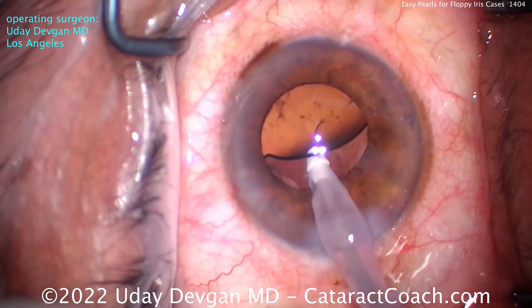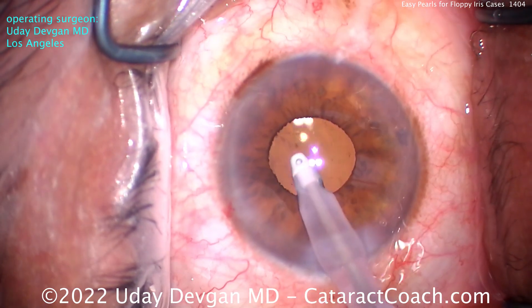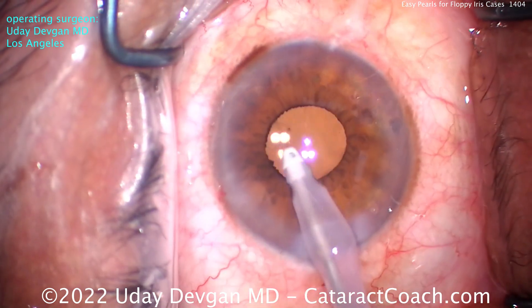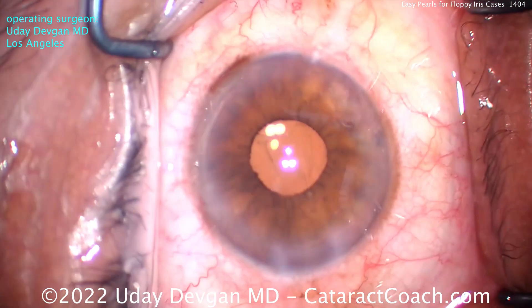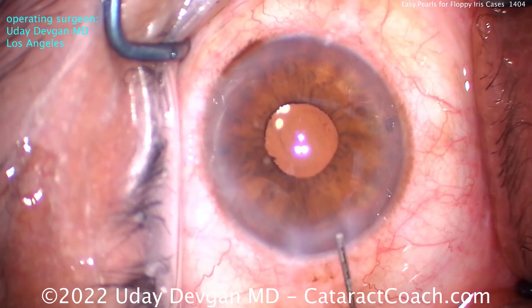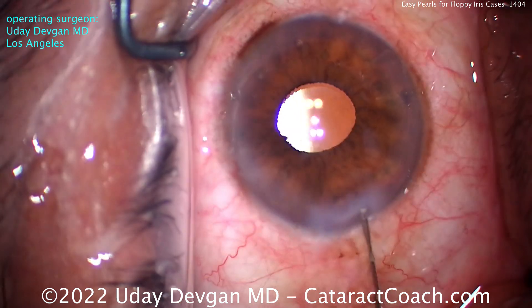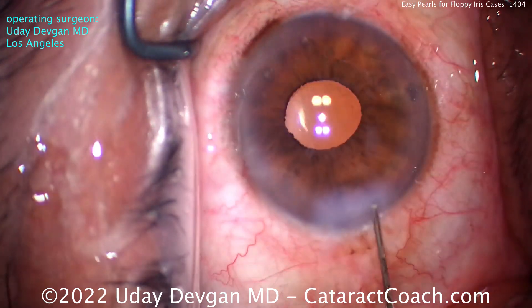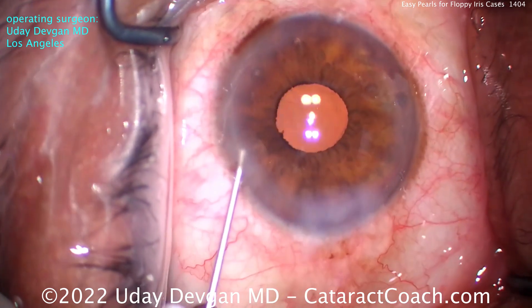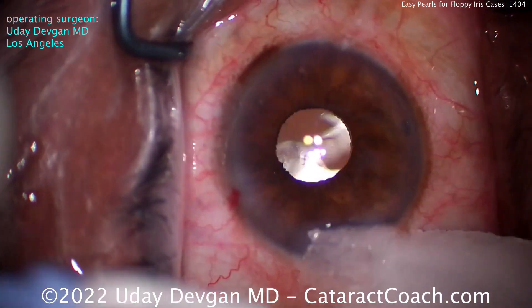Now remove the viscoelastic. Even though the pupil's small, go behind the lens and get the viscoelastic out. The iris wants to billow and cause other issues, but you can learn this technique. If you have a patient who's floppy iris — takes Tamsulosin or Flomax — you can still get these cases done in a highly efficient manner. Sealing up that incision, which looks pretty good. We didn't touch the iris the entire case and everything goes beautifully. Five minutes and you're done with the whole case. The patient's going to have a beautiful outcome with minimal manipulation.